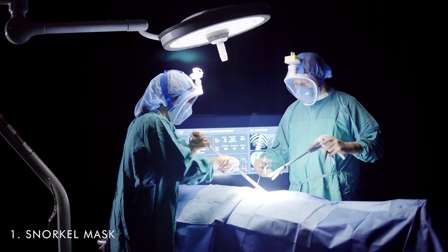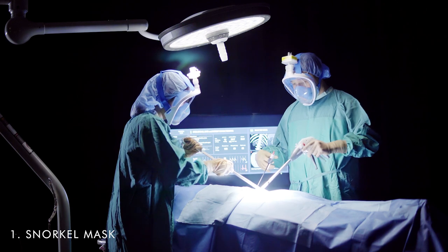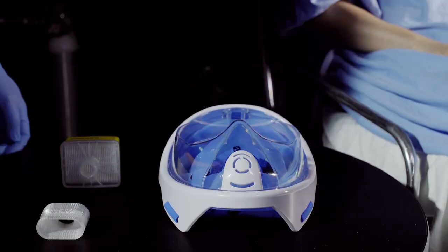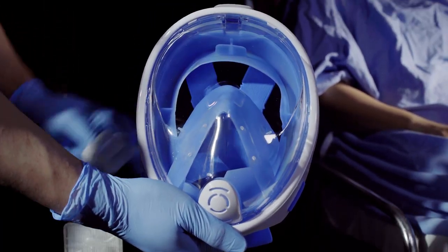Our team has modified a full-face snorkel mask to protect providers against both airborne particles as well as droplets. The mask is reusable and will function both as a face shield as well as an N95-equivalent respirator. We modified it by adding a 3D-printed custom-fit adapter to the top outlet, which is then connected to a hospital-grade HEPA filter with 99.99% filtration efficiency against both viral and bacterial particles.